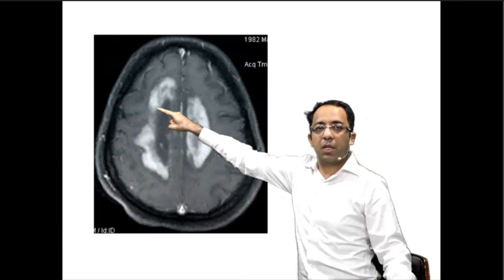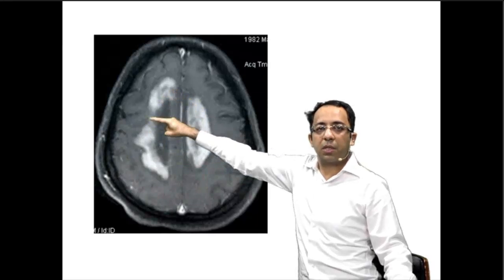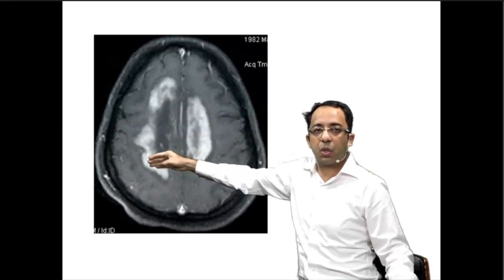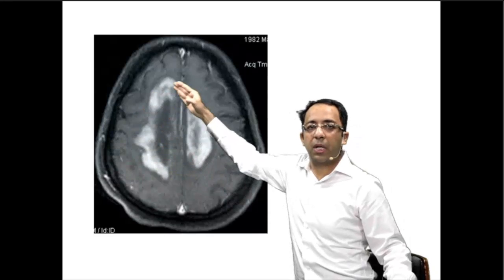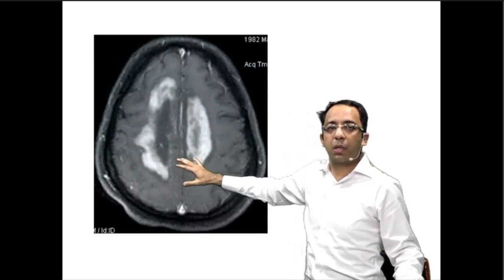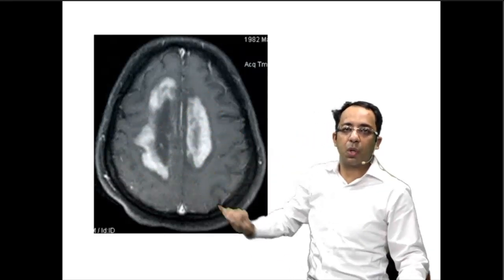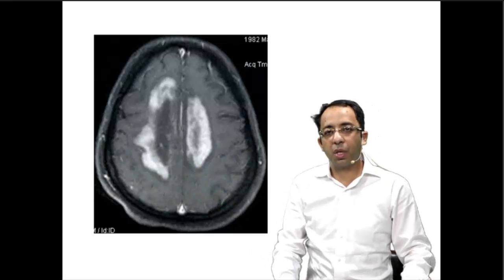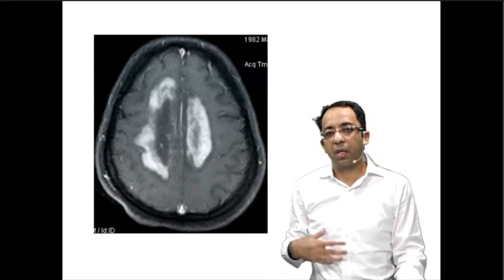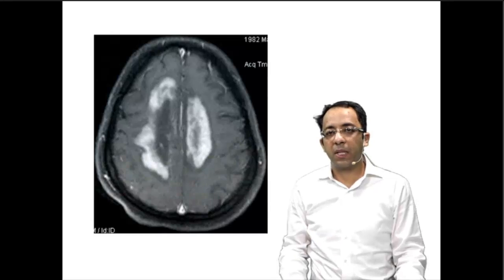On the contrast enhanced image you can see that there is enhancement on one side of the lesion while the other side is not enhancing. This is called open ring-like enhancement. The lesion almost shows a ring-like enhancement all around, but it is open. So you have an open ring-like enhancement. What do you think we are looking at?